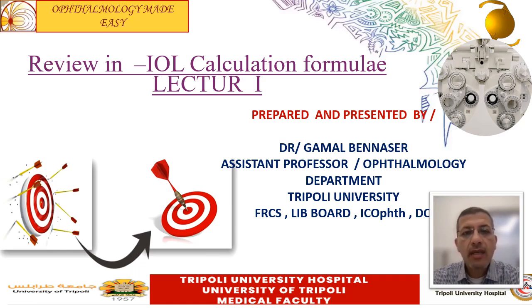comes concurrently with the evolution in the techniques of phacoemulsification, also in the evolution of the manufacturing of the intraocular lenses and the evolution in the premium lens IOLs, and also the elevation of the expectation of patients for having a very accurate result after cataract surgery. And as you know, for a successful cataract surgery, you need very sophisticated, very advanced and safe phaco machines, as well as much improvement in the skills of the surgeons, and this should be concurrent with an accurate prediction of the post-operative refraction for patients.